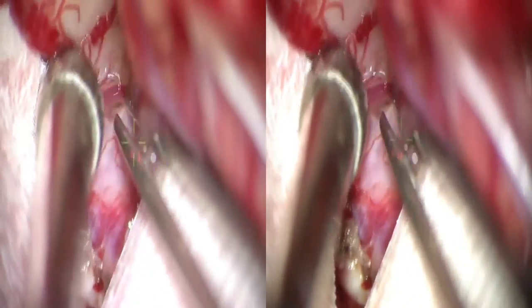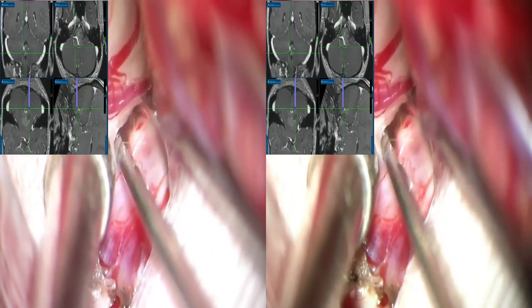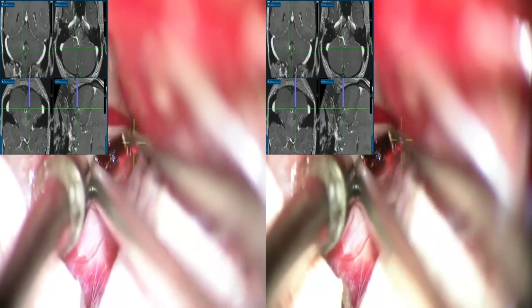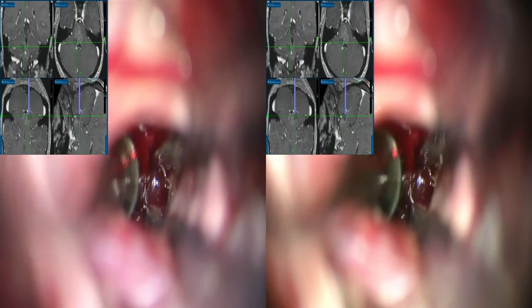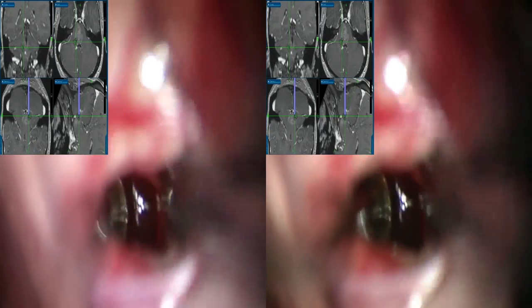Once the telovilar craniotomy is performed, neural navigation is utilized to obtain a point of ideal entry into the brainstem to resect the cavernous malformation. In the dorsal pons, several safe entry zones have been described to resect lesions deep to the pial surface. We elected to utilize the superior fovea safe entry zone given that this lesion was located at about the level of the facial colliculus. A small opening is placed into the brainstem and by stretching, the opening is enlarged just enough for a suction and a micro instrument to be placed within the opening to resect the cavernous malformation.